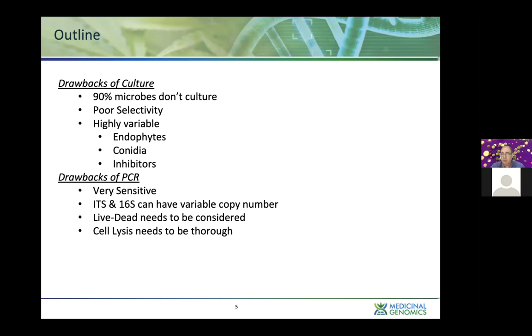There were some standards brought to market from organisms that we've never found on cannabis, Candida in particular, that are very difficult to lyse. And we had to engineer new lysis reagents to actually tackle those. Again, that was an off-target item for us because we had not seen that organism in cannabis microbiome studies. Nevertheless, it is a standard that's been evolving in the field. And so we've had to modify protocols so we can appropriately lyse those things and be concordant with them.